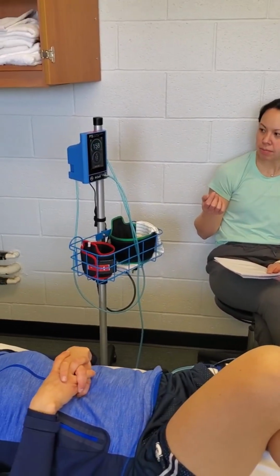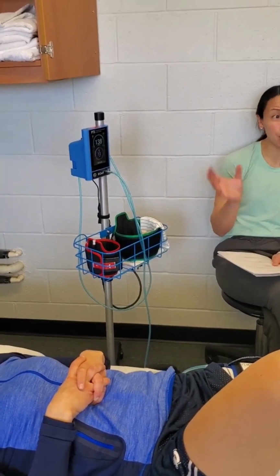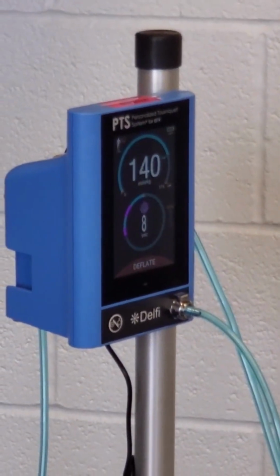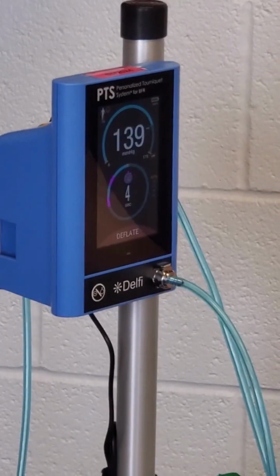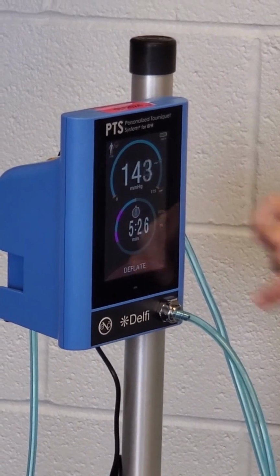Well, it doesn't deflate though, so it'll just stay inflated continuously. She could just remember to rest for 30 seconds and be like, oh, my 30 seconds of rest are up. Oh no, it's my next set of 15. It just won't continue to keep track of it. See how it turns green. Yeah. All right, Kendall, go ahead.